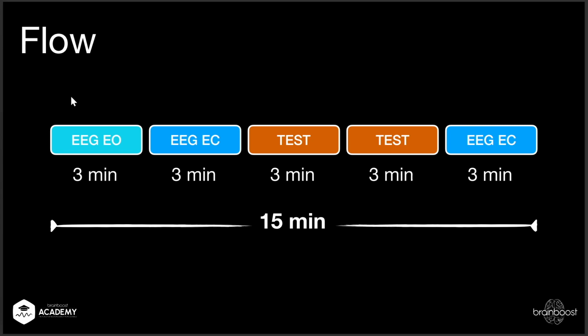So the advantage of a flow is that you can standardize your measurement. For example, your first consultation or all three sessions, you want to do some sort of standardized, maybe only a test in one eyes open segment that only goes for 2 minutes. So it doesn't have to be the flows that we create and send to you. You can create your own. And this is what I'm going to show you in this webinar, how you can create your own.